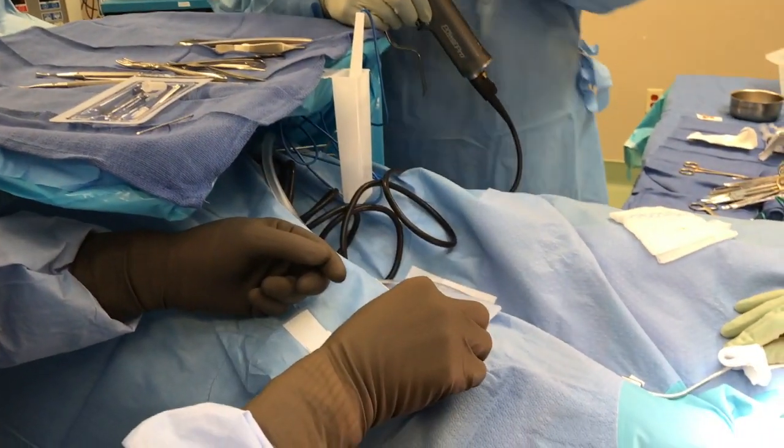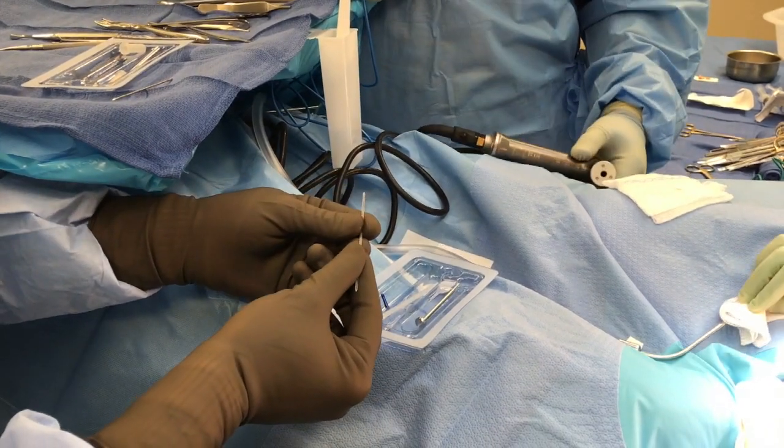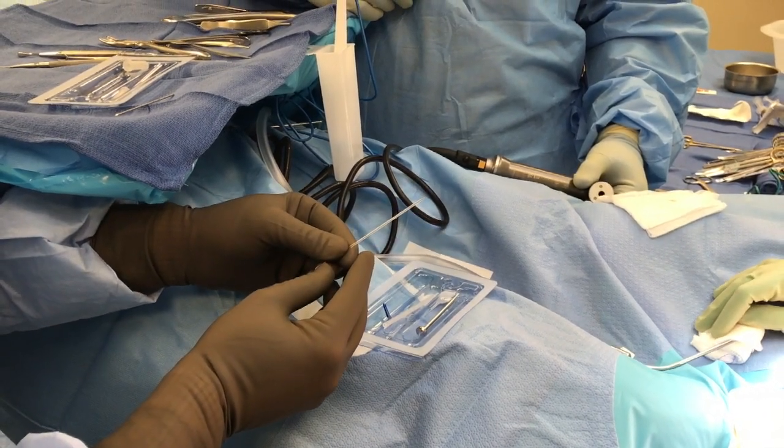The device itself is clear and non-metallic. It's bendable, so if the toe is too straight, we can actually flex it down, and I'll demonstrate during the procedure.